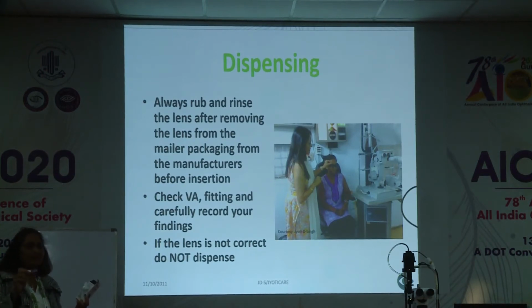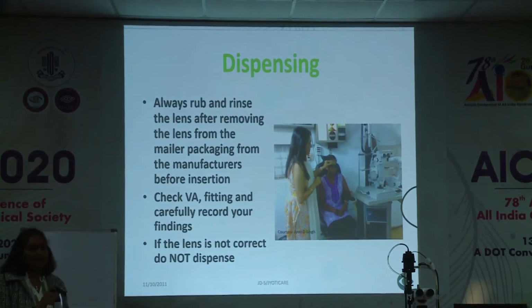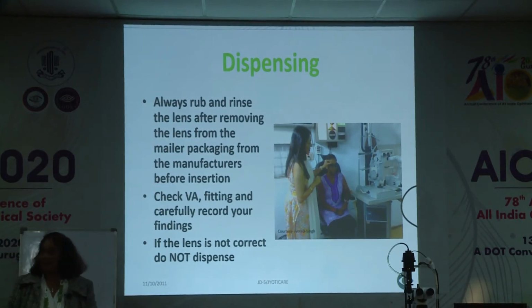So please remove the lens from the dry container and put them in here and soak them in this solution for minimum half an hour before you dispense the lenses. That is very, very important. I've seen a lot of doctors in India just give the dry case to the patient and say, now you go and do whatever you want. There is no proper formal instruction to the patient on how to maintain their lenses.